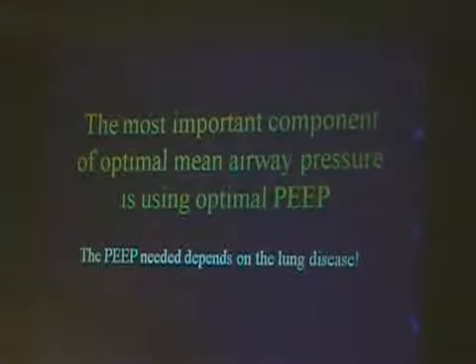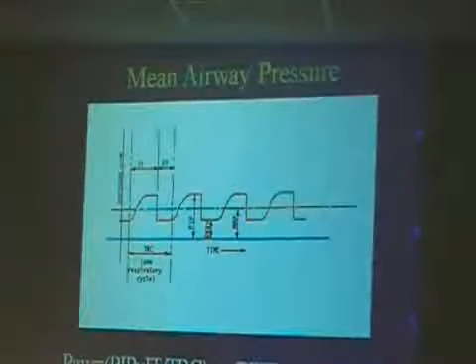If there's anything else today about oxygenation that you need to know, and it will apply also as we go into high frequency, it is optimal mean airway pressure, optimal PEEP. The PEEP that's needed depends on the lung disease. If you have a baby with no lung disease, the PEEP that you need is going to be much less than if you have a baby with a lot of atelectasis who needs a higher PEEP. We have to be very careful about not being, as we all say, PEEPophobic, which means afraid of using the PEEP that we need to open the lung. The PEEP that we need depends on the disease that the lung has.